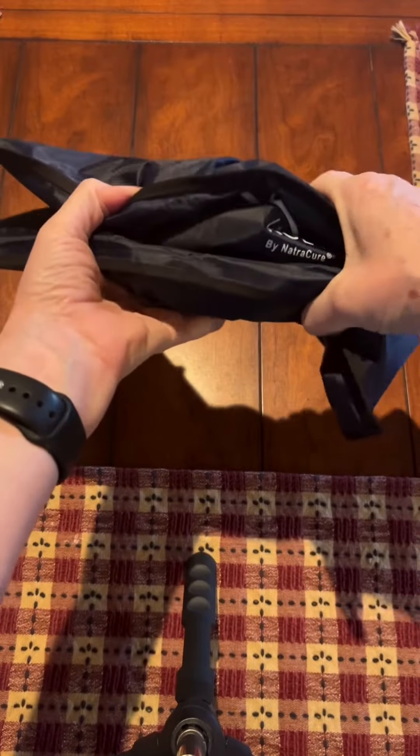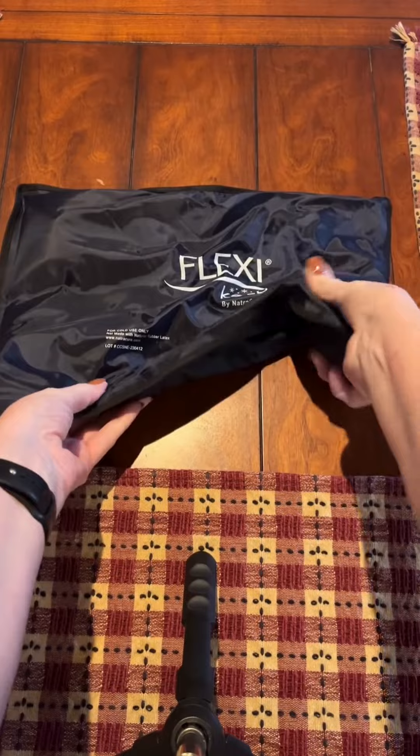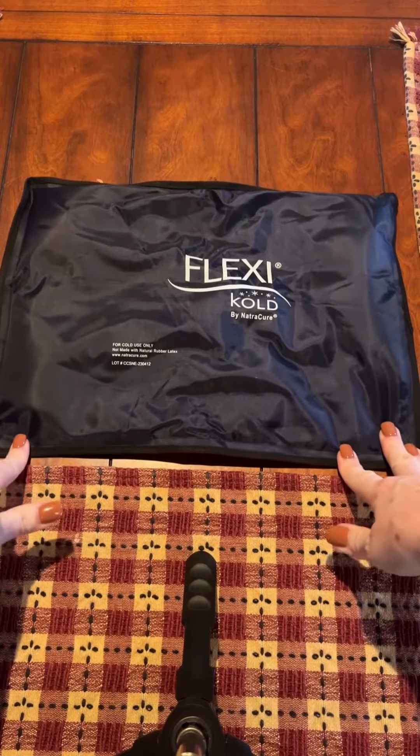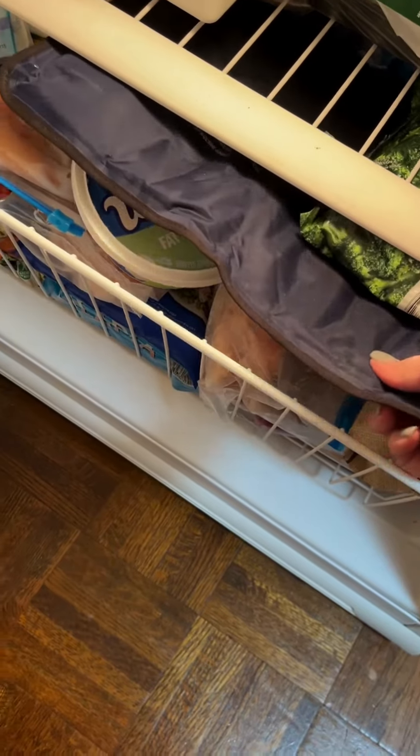This is a flexible ice pack even when frozen. It is double stitched around all seams, which keeps the gel from coming out. I've had it eight months and had absolutely no trouble.